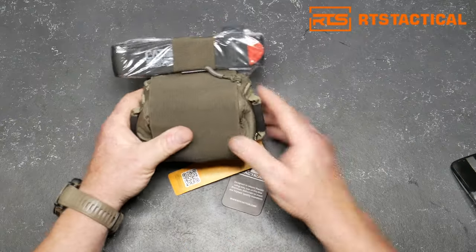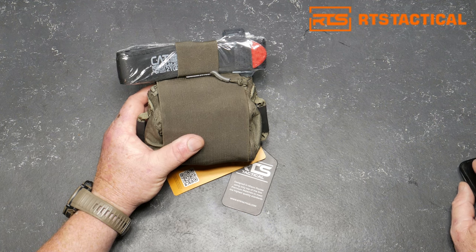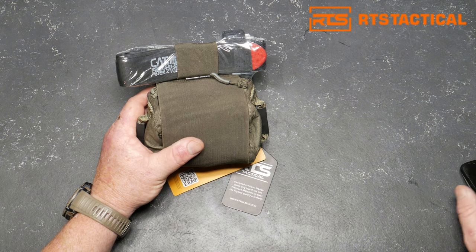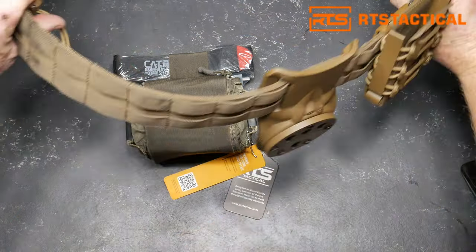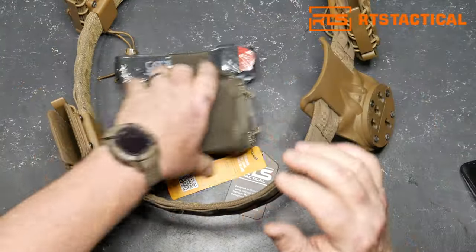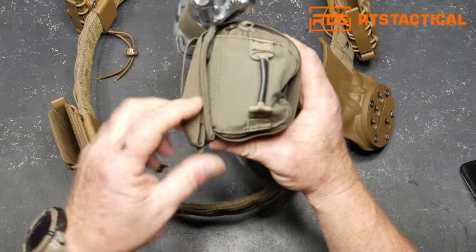Let's talk about this — the RTS Tactical IFAC Mini is your unwavering companion, embodying preparedness in its most compact form, sized right for everyday carry. This is my belt, what I use when I'm out and about. On the back you have the MOLLE webbing attachments — this is a pretty cool little feature, new to me.